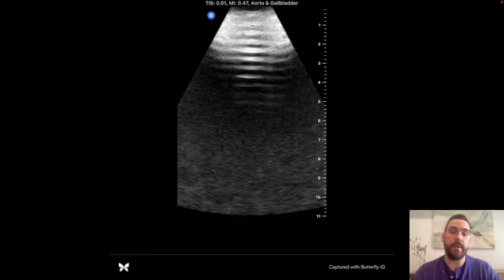An abdominal aortic aneurysm is defined as an aneurysm diameter greater than 3 centimeters. Usually we're pretty concerned above 3, but certainly as it gets to 5, 5.5, that's indications for surgical intervention. So as we're screening our patients, that's an important number to have in our mind.